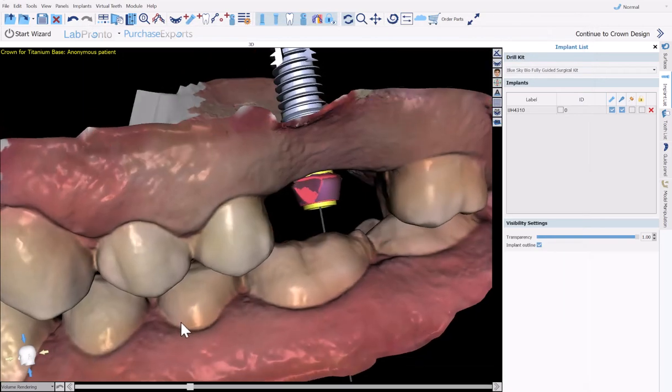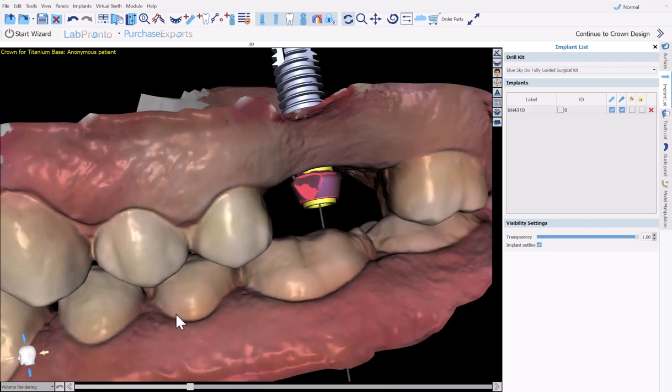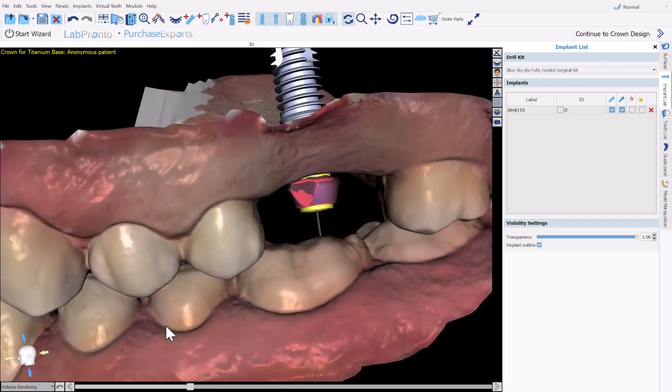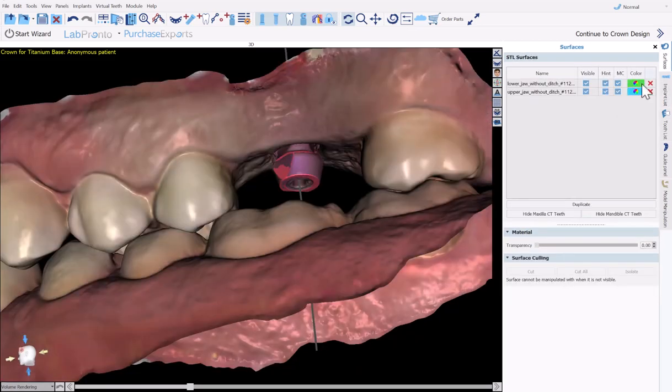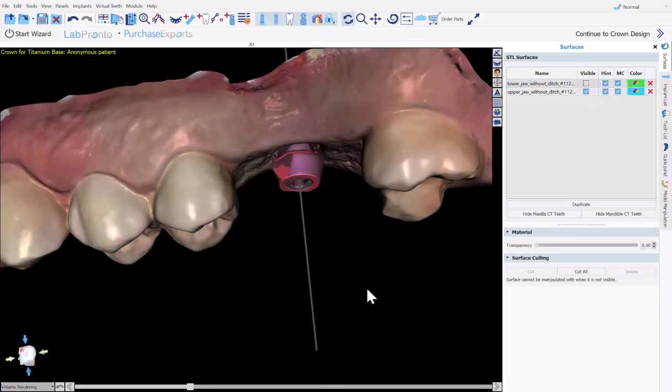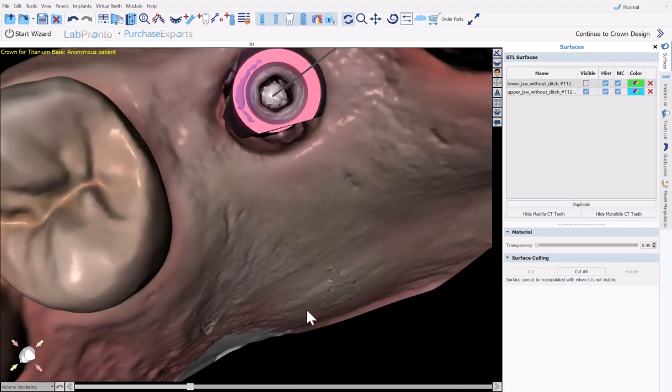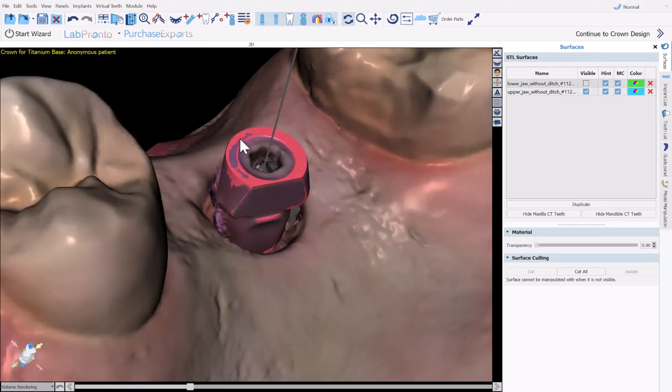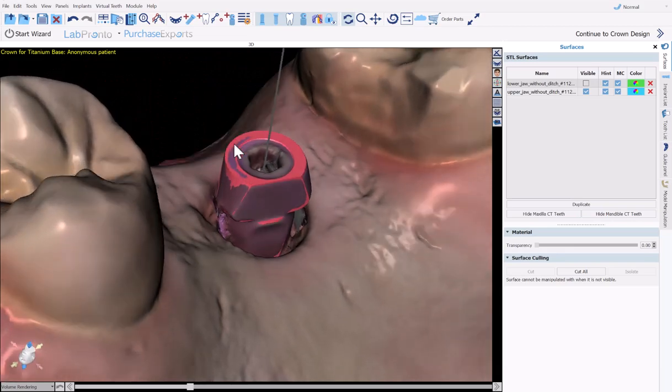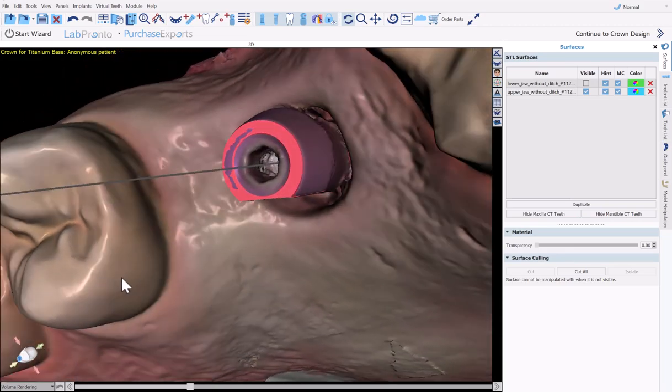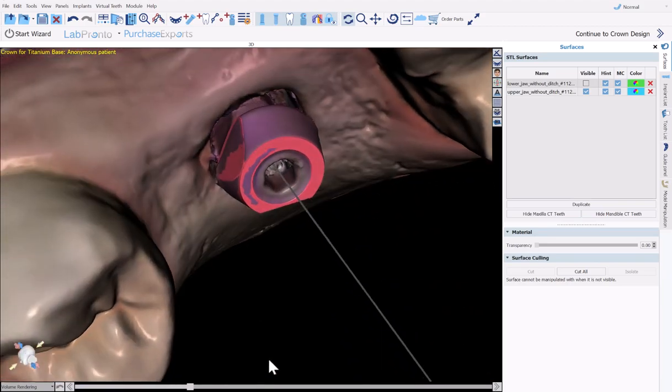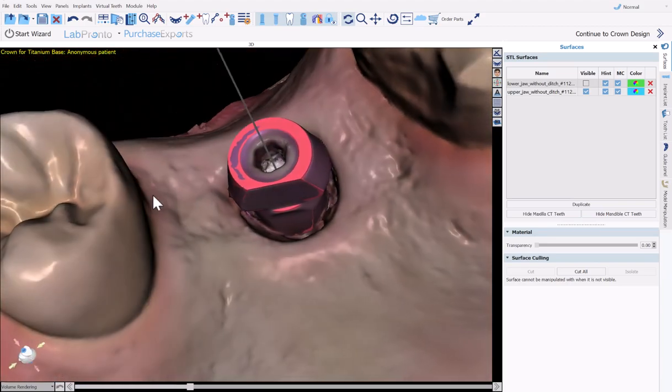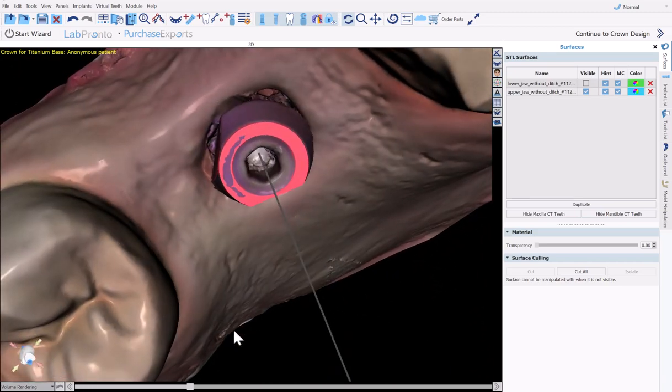We can now see that the scan body has been aligned to the scan body from the scan, and the abutment and the implant has been added as well. If we hide the implant and the abutment, and turn off our opposing arch, we could see the alignment of the scan body from the library to the scan body in the scan.